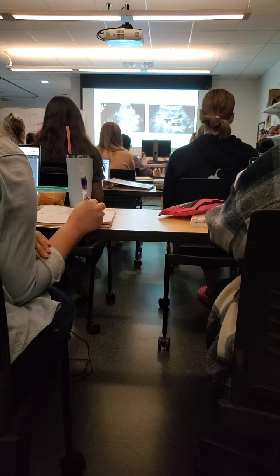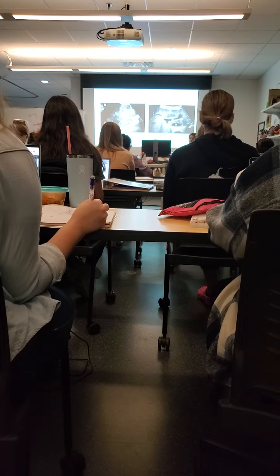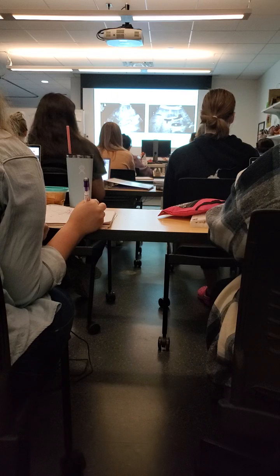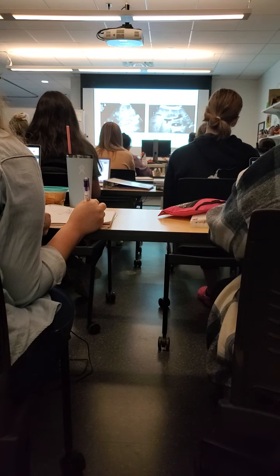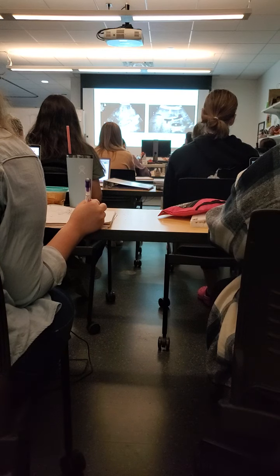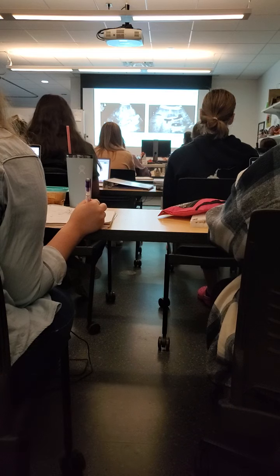And Shay will teach you guys this. So this is your first time looking at it. That's why I'm not going to overdo it for you, because I don't want you to memorize this. This just gives off notes of the fatty liver. We call it sparing, I think, fatty liver sparing. That's the part of the liver that has been spared. The rest is all fat.